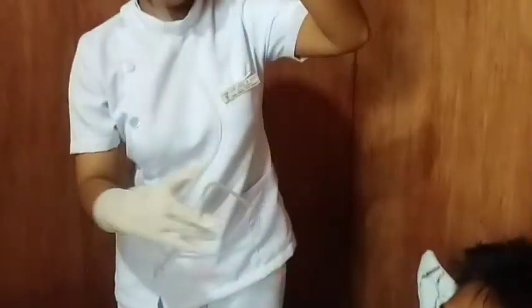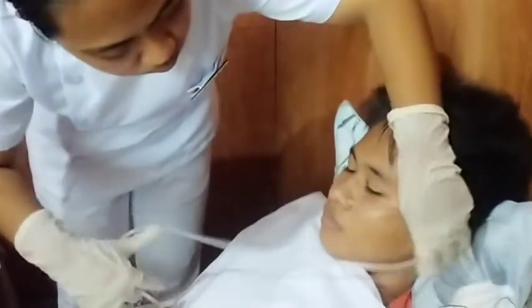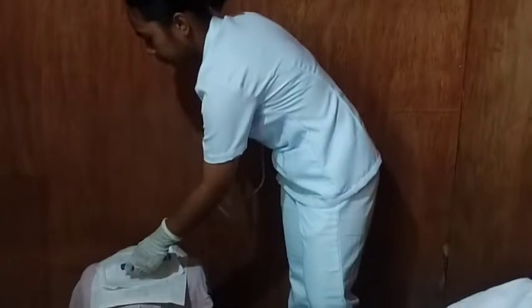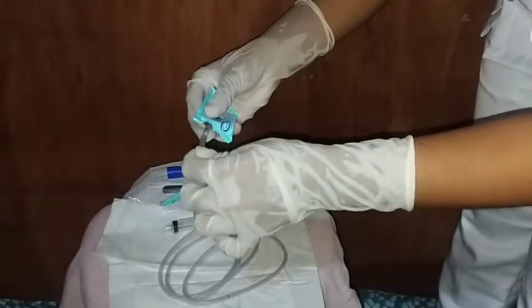Determine how far to insert the tube. Use the tube to mark off the distance from the tip of the client's nose to the tip of the earlobe, and then from the tip of the earlobe to the tip of the xiphoid. Lubricate the tip of the tube well with water-soluble lubricant or water to ease insertion.